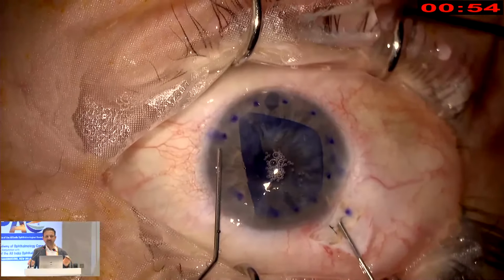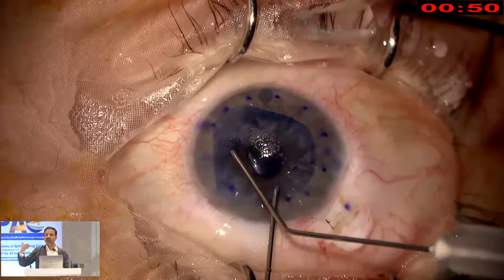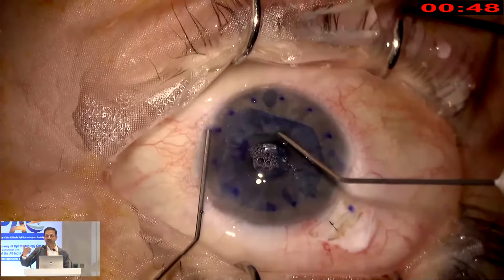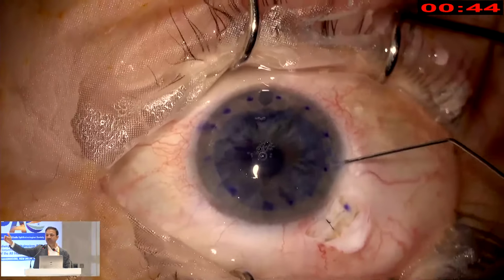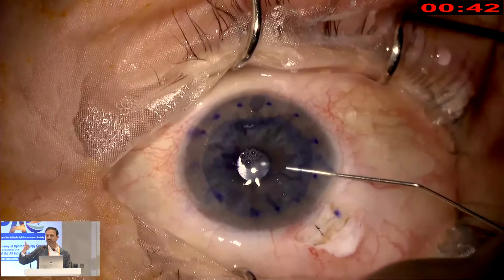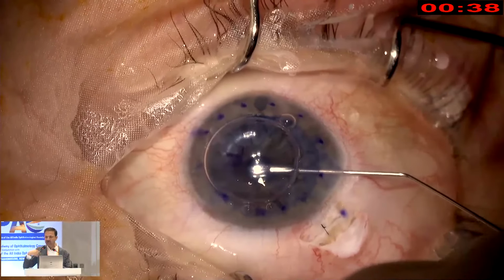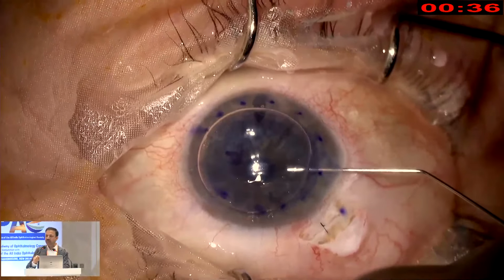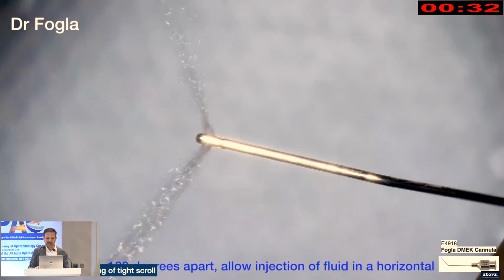And remember that, unlike a DSAEK graft where you stroke on the surface of the graft to make it move, here you don't stroke on the surface. Stroking on the surface will be counterproductive because you move the fluid like that, then the fluid rebounds, and the rebound carries your graft in the opposite direction. So always go outside the graft and with the two cannulas tap to create ripples, and then you will find that your graft will slowly move forward.